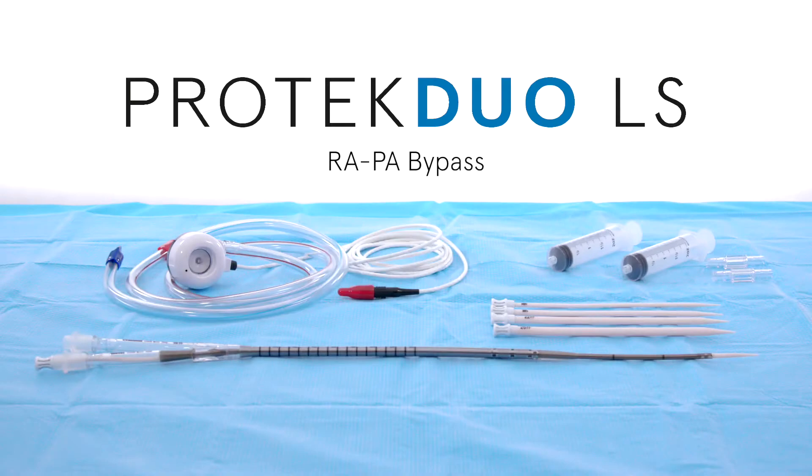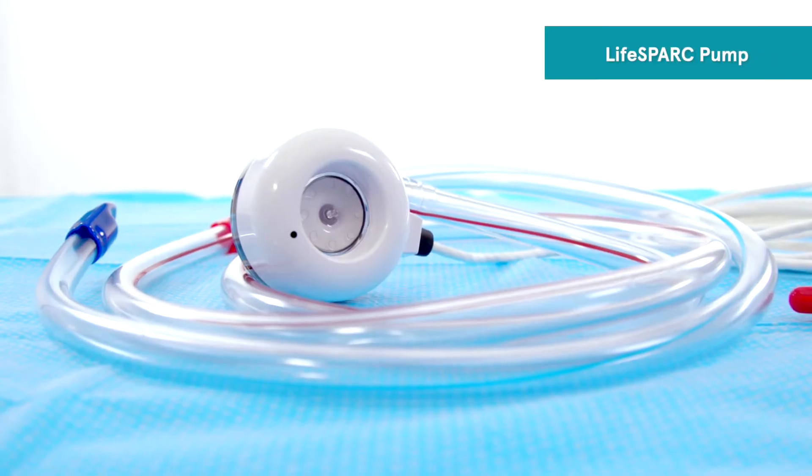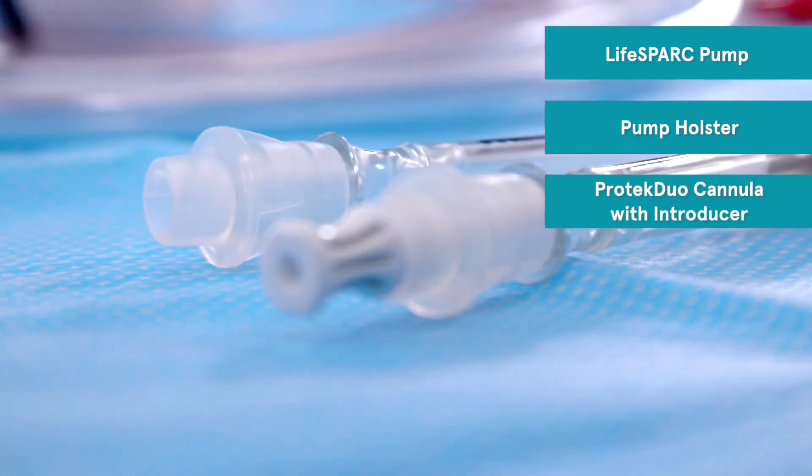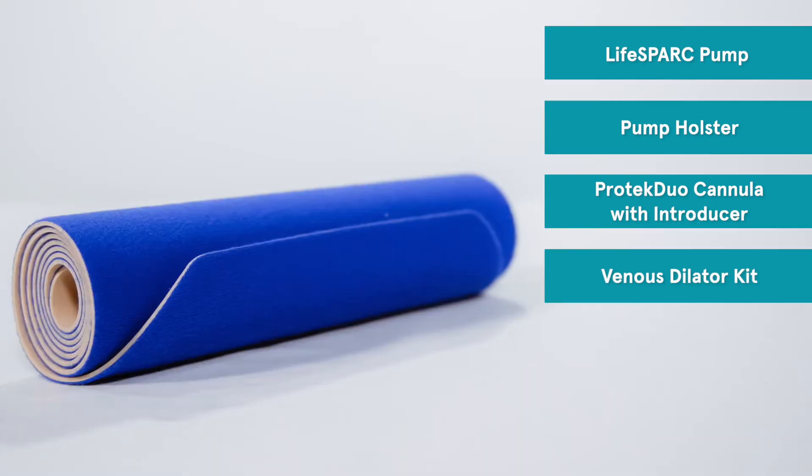The Protec Duo RA-PA bypass kit includes a LifeSpark pump, a pump holster, a Protec Duo cannula with introducer, a venous dilator kit, and a thigh wrap.